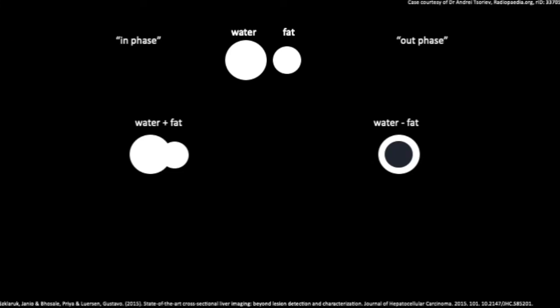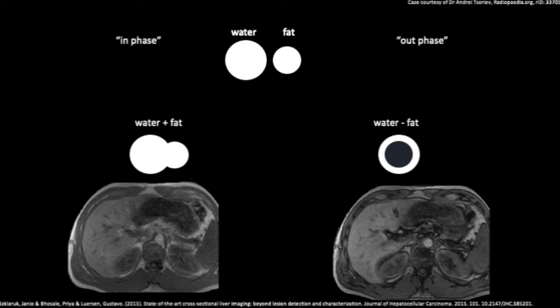Here are examples. In-phase on the left, out-of-phase on the right. On the out-phase, notice there is no signal drop, meaning no microscopic fat, no hepatic steatosis.